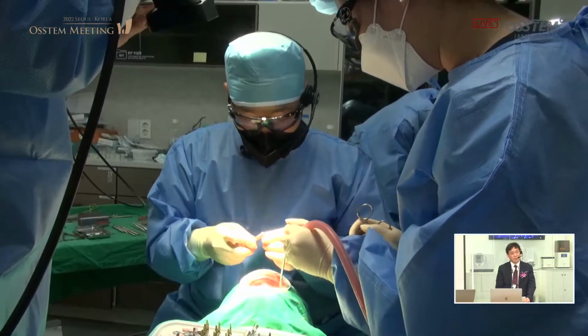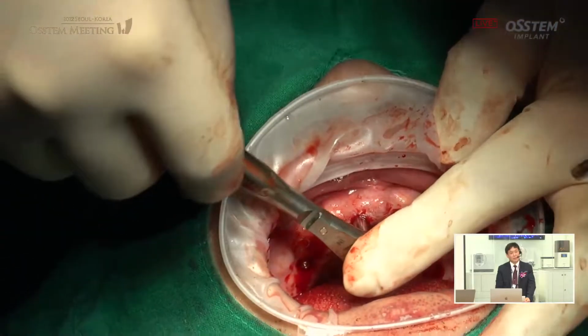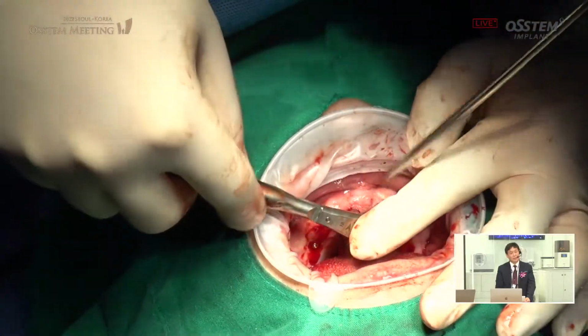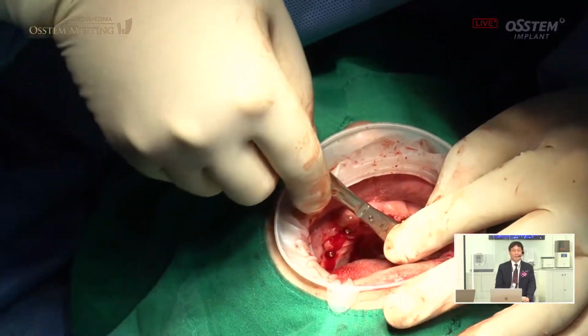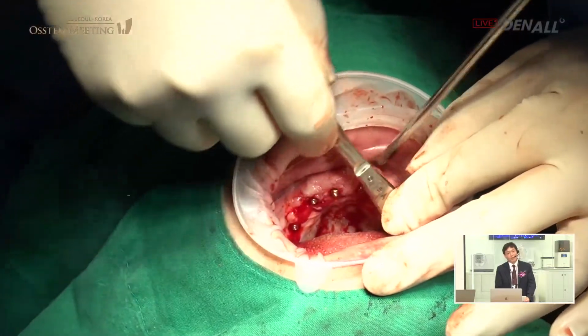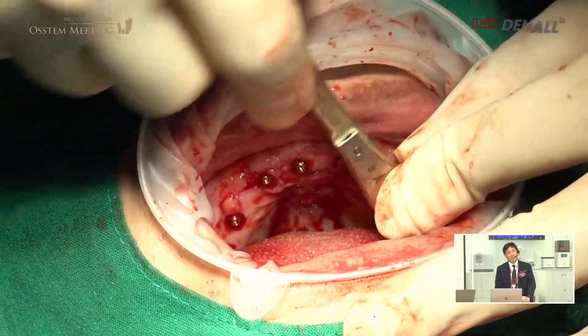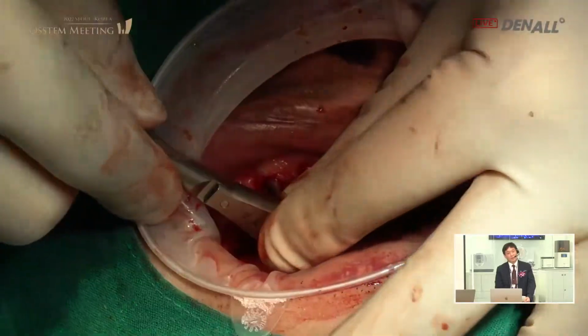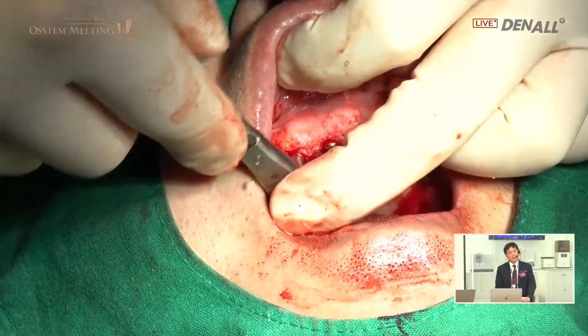If you apply torque wrench, at times it can be difficult to apply force. So this is a little bit of challenge for me. You're tightening by 30 Newton? Yes. It's difficult because there's gingiva.